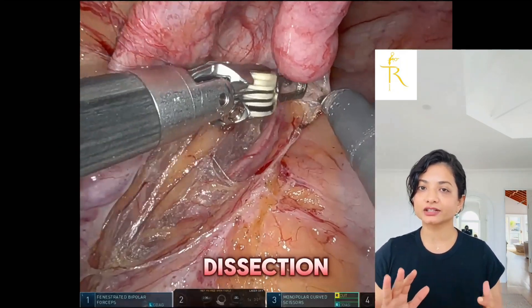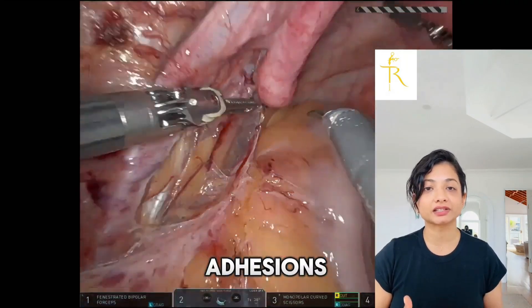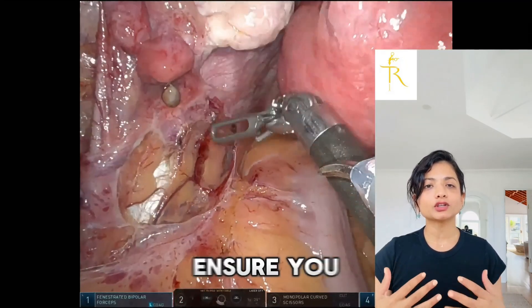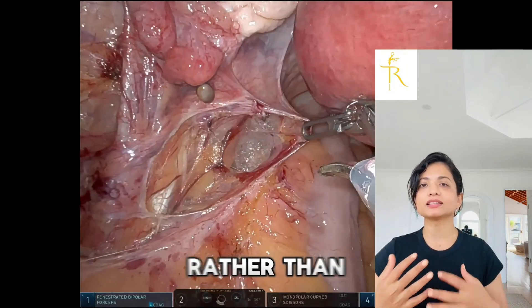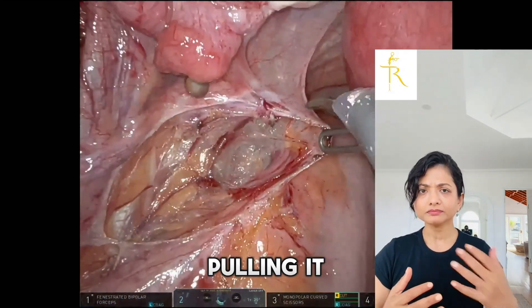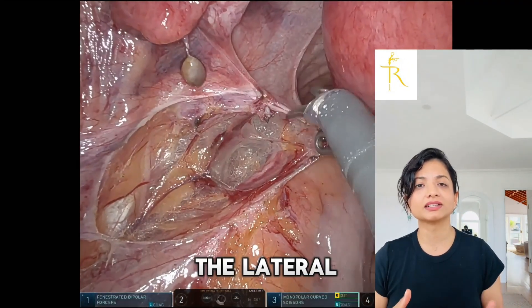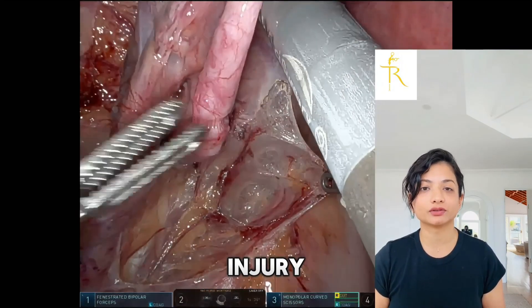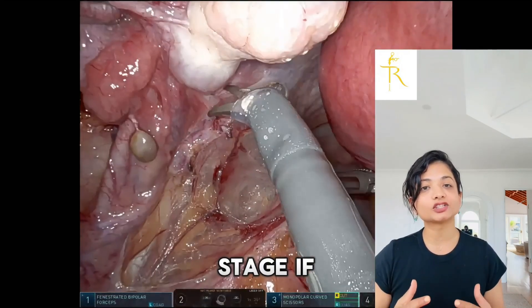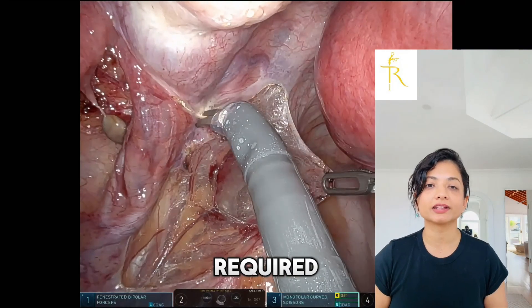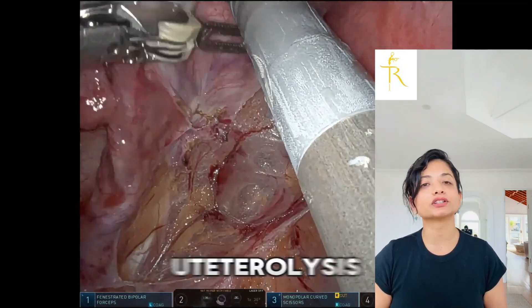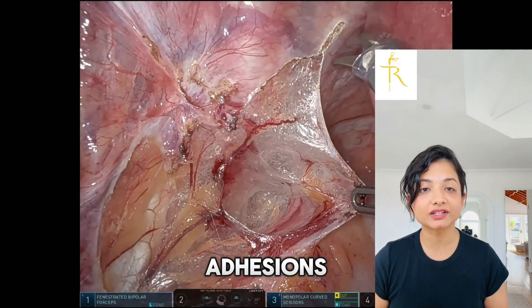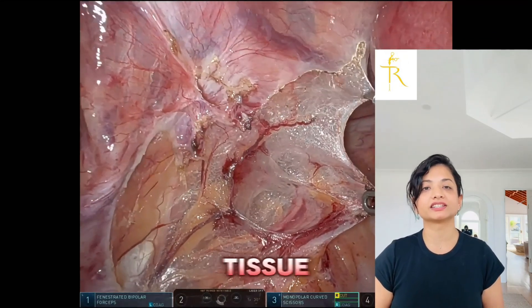Gentle dissection clears the surrounding adhesions, particularly if there is fibrosis from endometriosis. It is important to ensure you stay above the ureter rather than pulling it in the lateral direction, as excessive traction can cause injury. At this stage, if deeper access is required, we can perform a ureterolysis, carefully separating the ureter from any adhesions or fibrotic tissue.